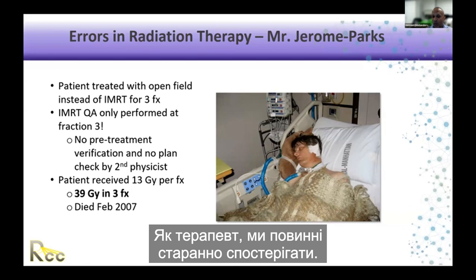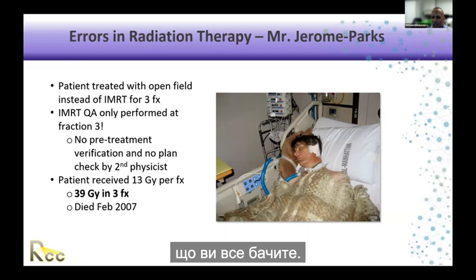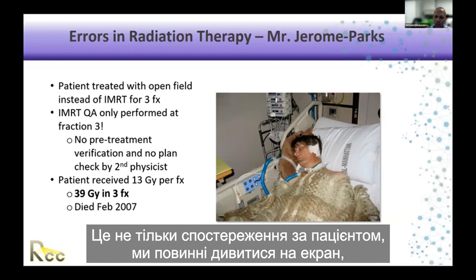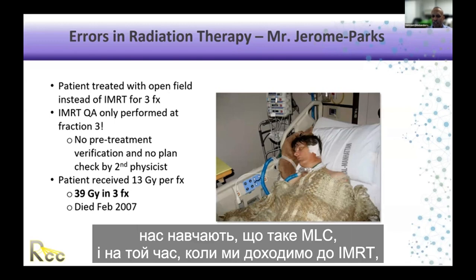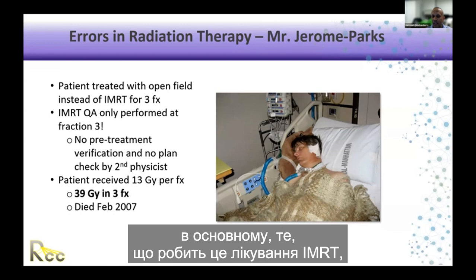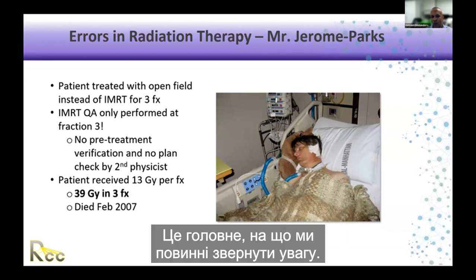As a therapist, we have to be diligent. Every time you treat a patient, make sure you watch everything. It's not only watching the patient, we have to look at that screen. We go to school, we get trained on what MLC is. And by the time we get to IMRT, basically what makes that treatment IMRT is MLC. So that's the main thing we have to look at.